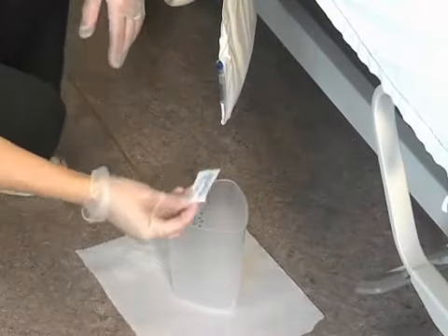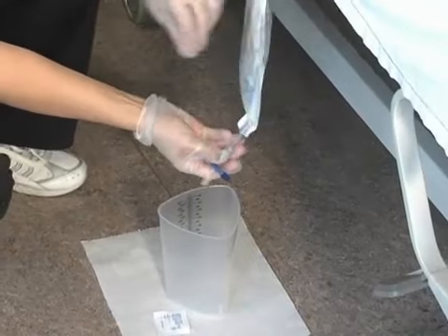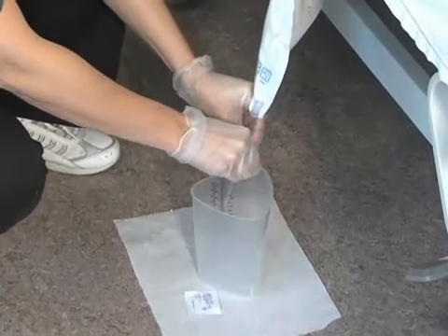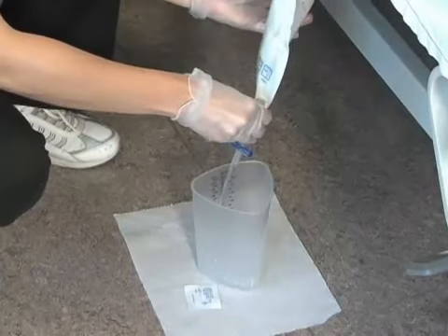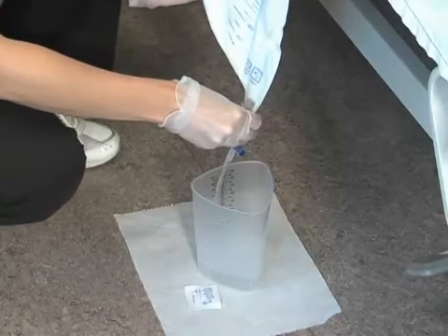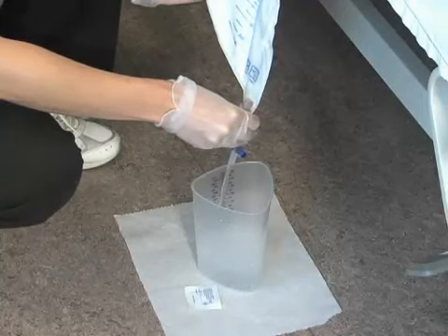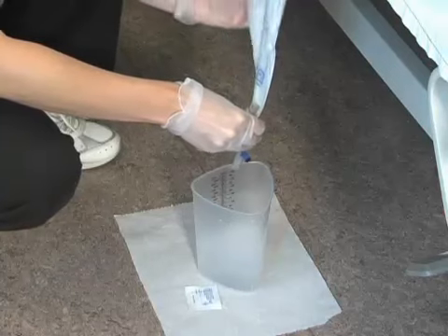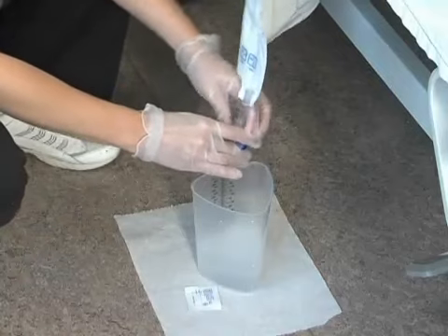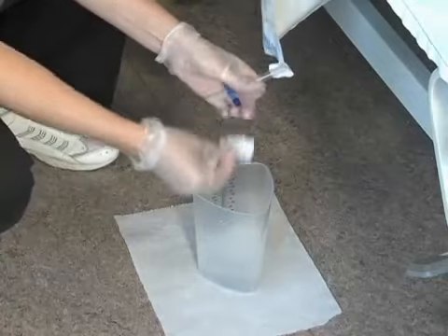I also need an alcohol wipe. So now I'm going to pull this little pouch out and then open it up. You need to make sure that you drain the catheter entirely. You need to seal it closed. Now you're going to clean with an alcohol wipe.